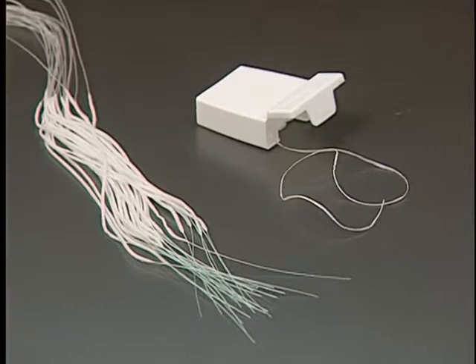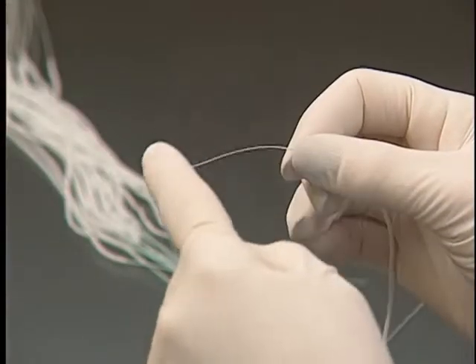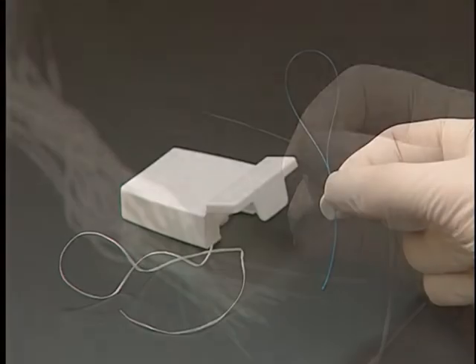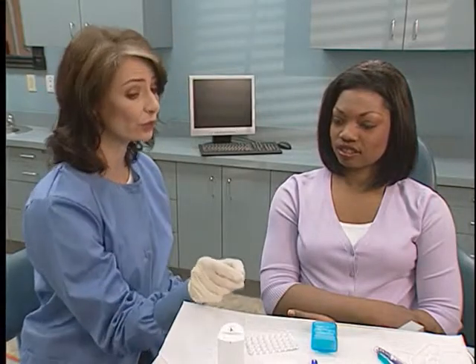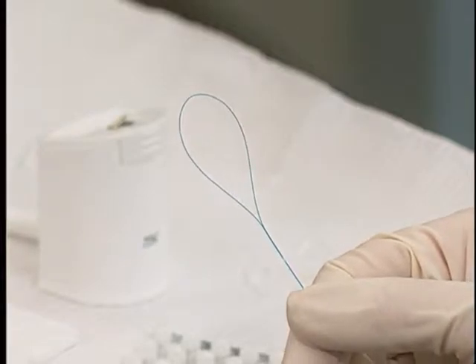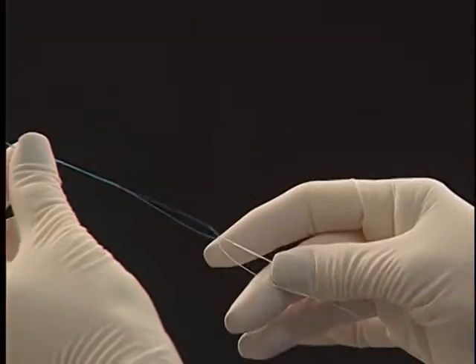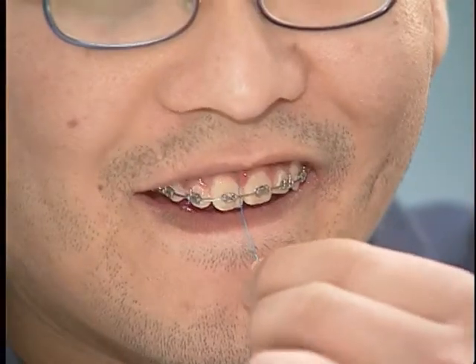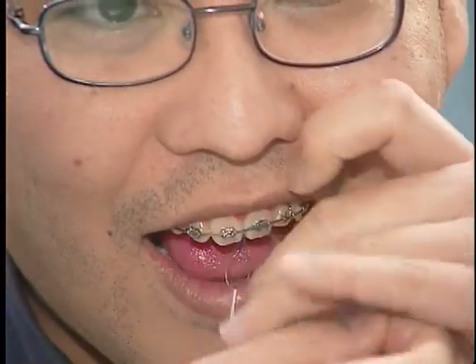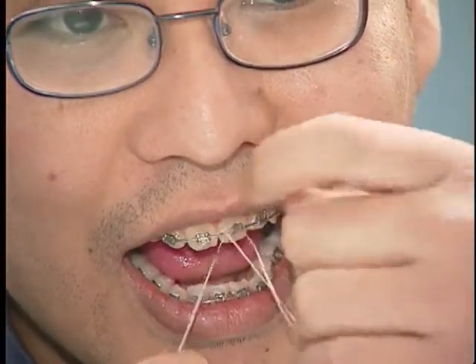There are several kinds of floss on the market. Just kind of experiment to see what works best for you. You can buy pre-threaded floss or use a floss threader and regular floss. A floss threader makes it easy for you to get the floss between your teeth and wires. Just cut off about 18 inches of floss and loop it through the threader, like so. Then run the threader underneath the arch wire of your braces, between two brackets. Hold one end of the floss, and you're ready to start flossing.